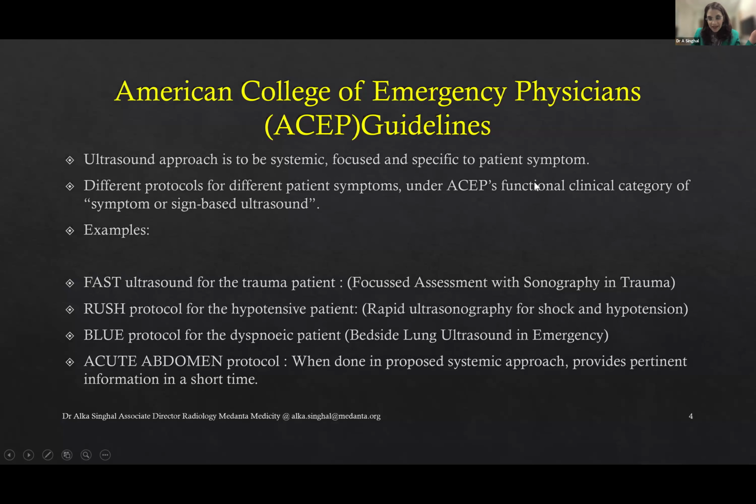Like symptom or sign-based ultrasound. For example, the FAST ultrasound protocol for a trauma patient, which is focused assessment with sonography in trauma, or a RUSH protocol for a hypotensive patient, which is rapid ultrasonography for shock and hypotension, or a BLUE protocol for a dyspnea patient, which is a bedside lung ultrasound in emergency.